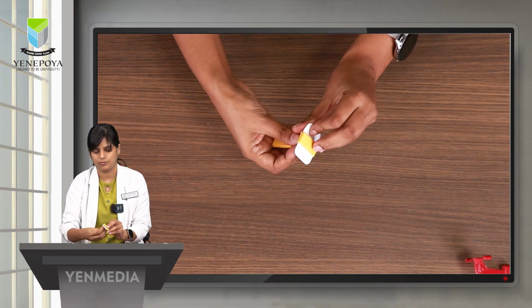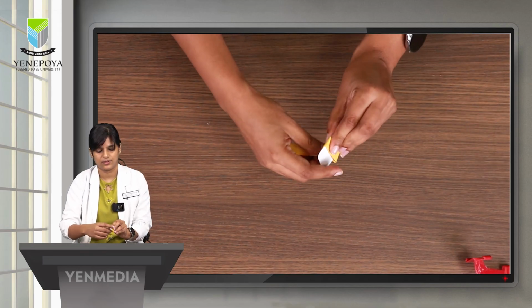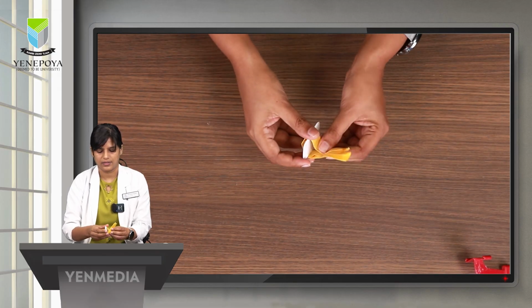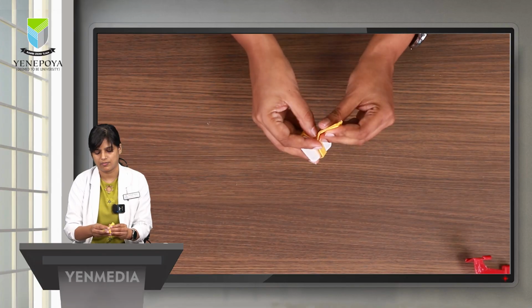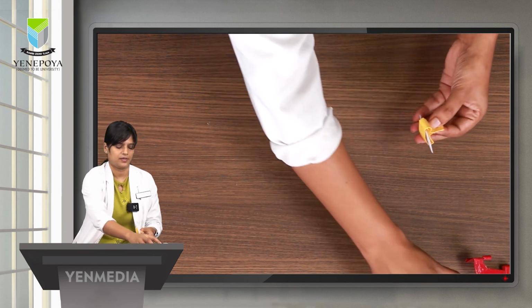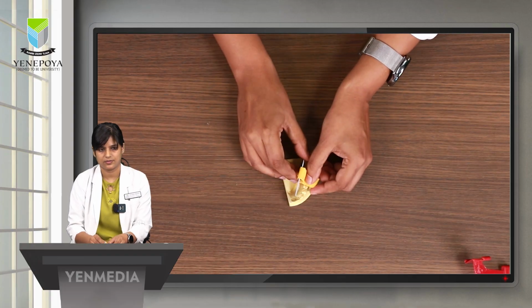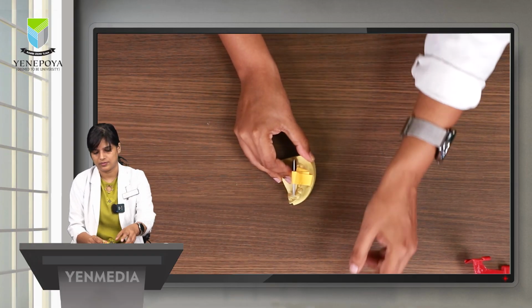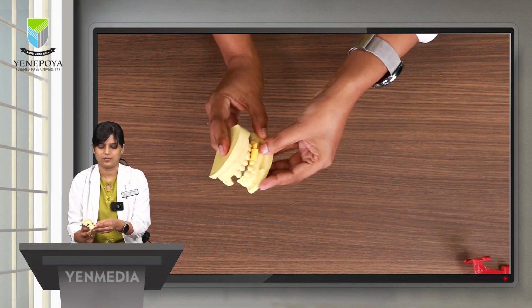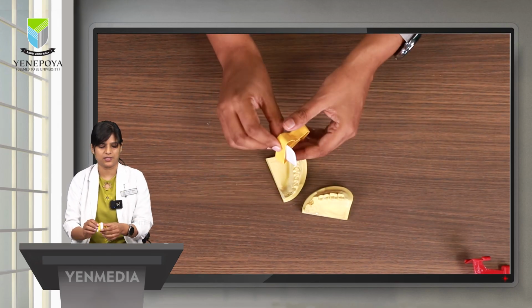The white part will be facing the PID, right, intraorally, and this will be the tab where the patient will bite, like this. So this is a makeshift just in case of emergency.